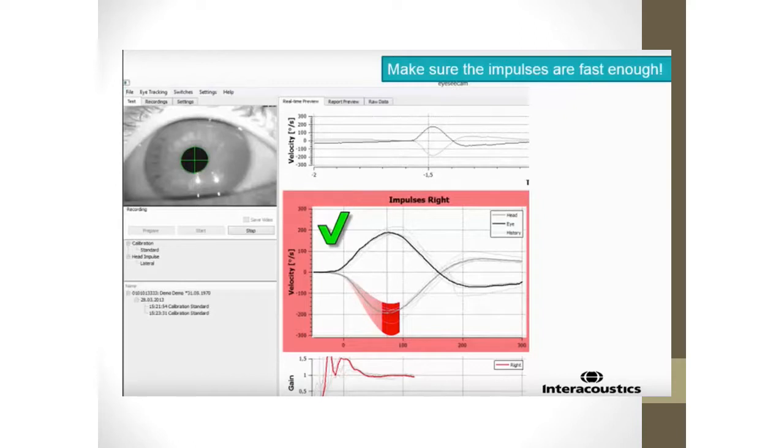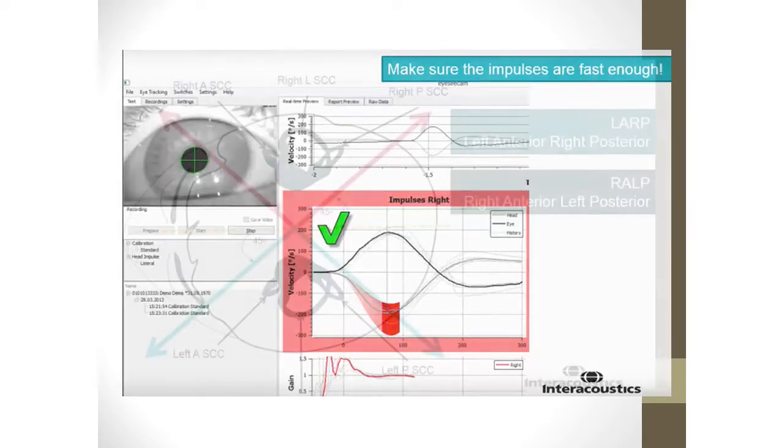And the system records head movement versus eye movement. You expect the eyes to move in an equal and opposite direction via the vestibular ocular reflex. You expect the eye to move in an equal but opposite direction of the head when you do this impulse.